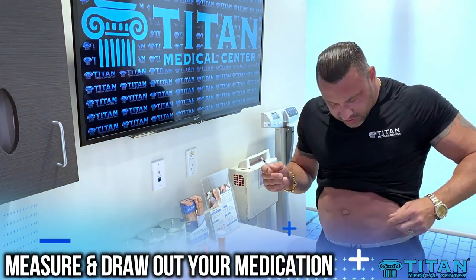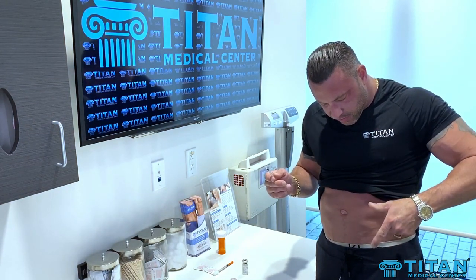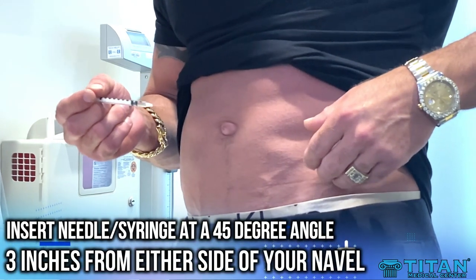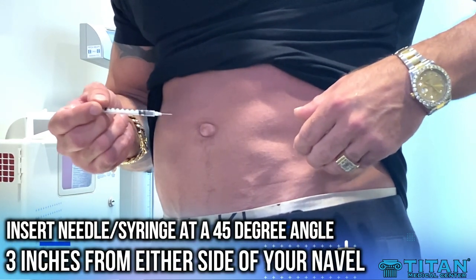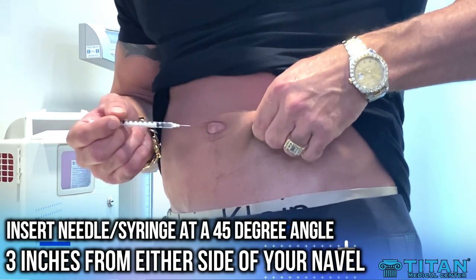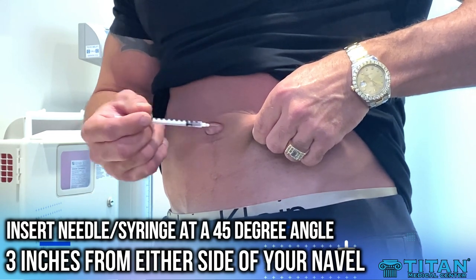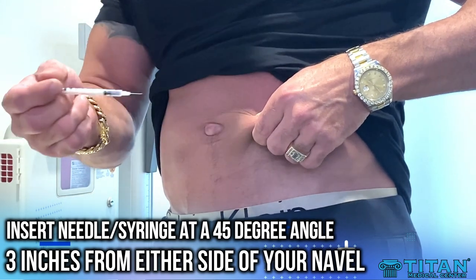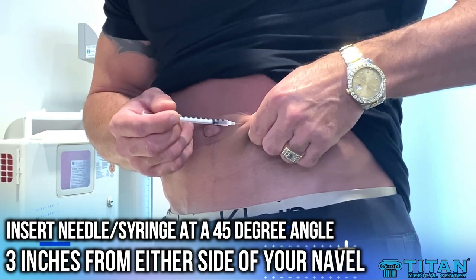The next thing I'm going to do is go three inches from the navel on my left side because I'm right-handed, and I'm going to go in at a 45-degree angle coming across my stomach with the needle. I'm going to pinch and grab some subcutaneous fatty tissue and go in at a 45-degree angle — not a 90-degree angle coming straight in, but a 45-degree angle going across.